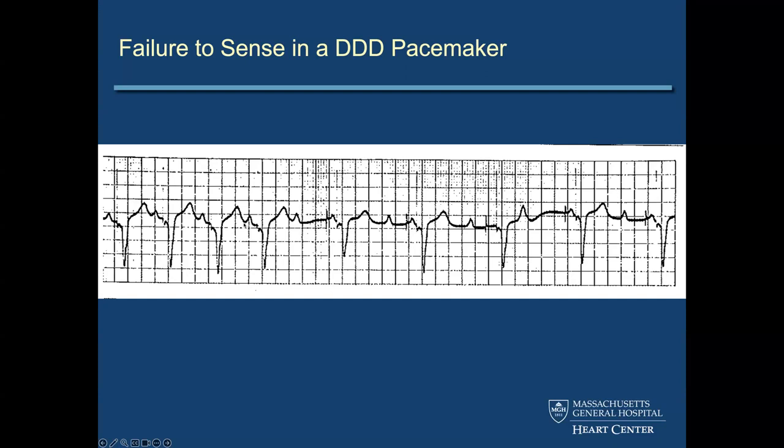So my question is, I think there's atrial sensing, but no ventricular sensing and pacing. Then it goes on and I can see atrial pacing, so not atrial sensing, atrial pacing and ventricular pacing. I'm very new in this, I just want to understand. When we set a pacemaker, maybe we set it to 60 beats per minute, so anytime it goes below that, that's when it should pace. So how come in the same ECG? I know that it's DDD, the ventricle is either sensing or pacing. So what determines when it paces? Like the first four, the atrium senses, it doesn't pace, and then by the fifth QRS, the P wave before it is pacing. What determines when it senses and paces in a run like this?